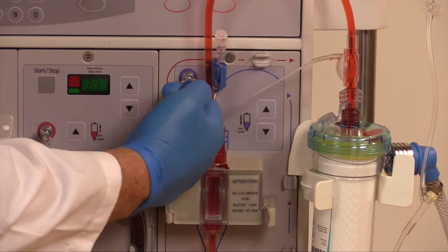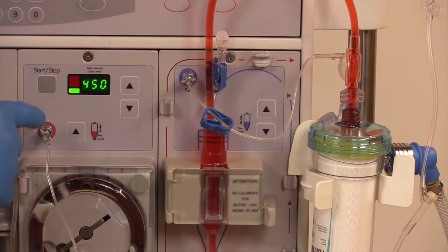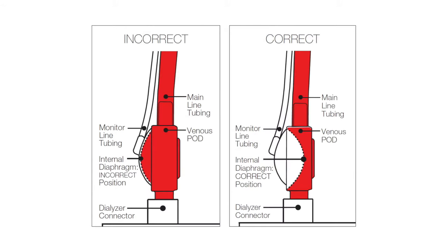Open the monitor line clamp. Restart the blood pump. Observe venous pressure and diaphragm pulsing midline within the pod.